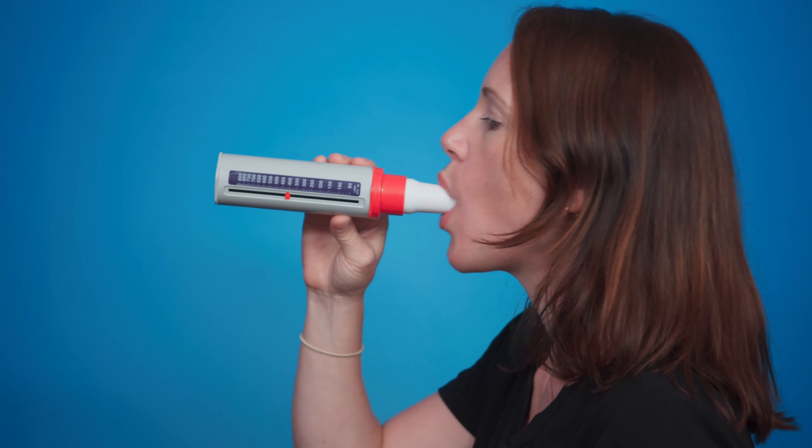You'd use the Peak Flow to help monitor your symptoms, especially if you're having an asthma flare up. It works really well in conjunction with a symptom diary. You can use it daily, weekly, or monthly to help you understand your asthma and your symptoms.